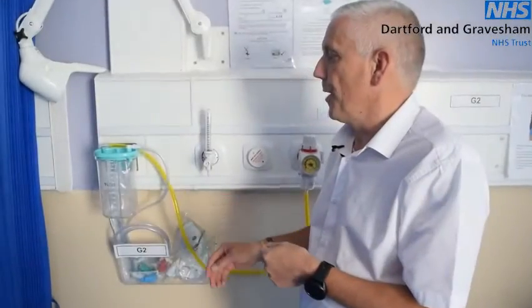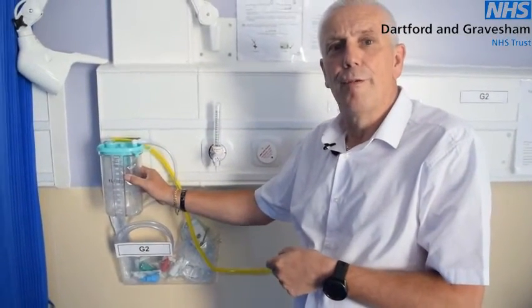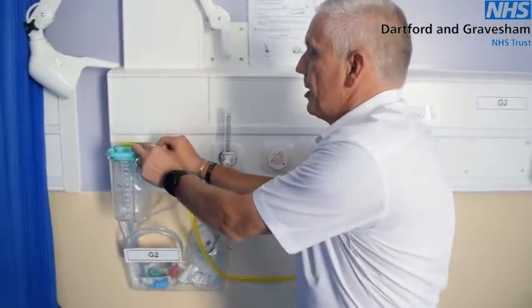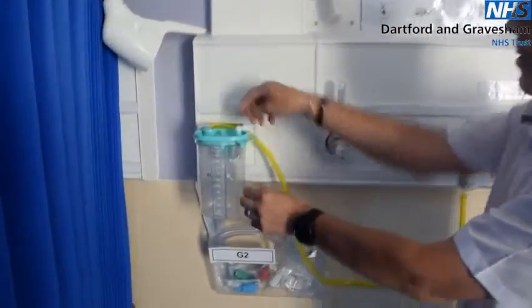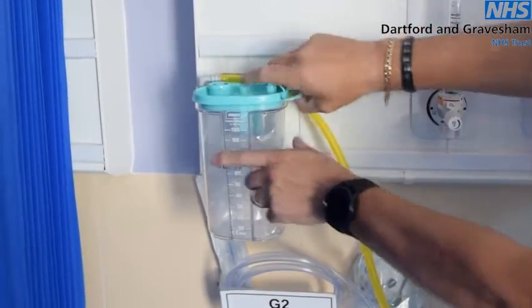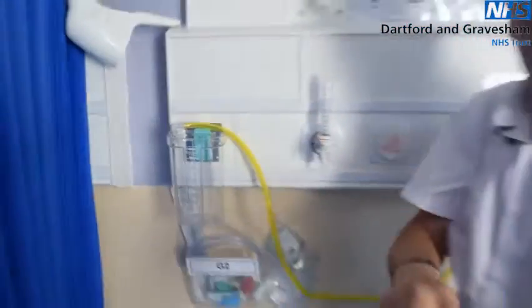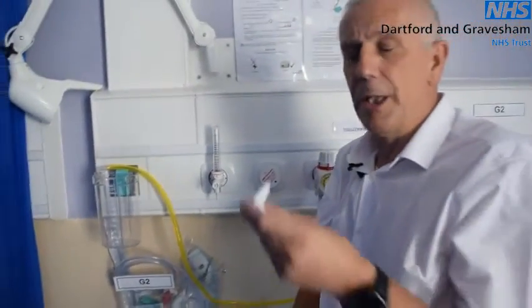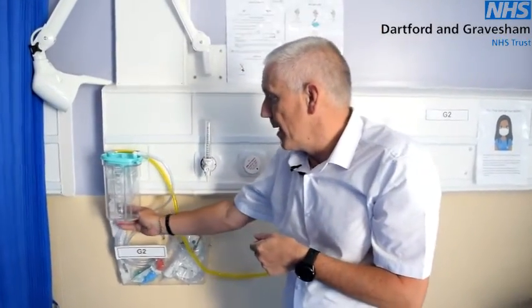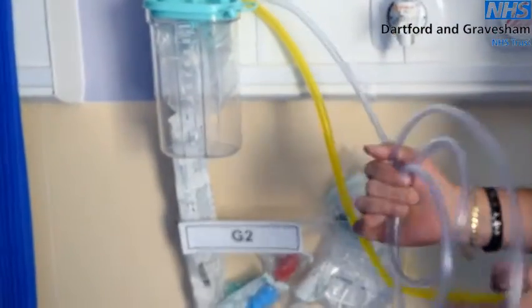When using the suction unit, do not overfill the jar. When the jar becomes three-quarters full, the jar liner should be removed. To do this, remove the tubing, take out the tubing nipple, push in the sealant, then lift off the jar liner — this can be disposed of and a new one replaced using the existing tubing nipple. Finally, the Yankauer should always remain in its sleeving, with the clear tubing ready for testing on a daily basis.